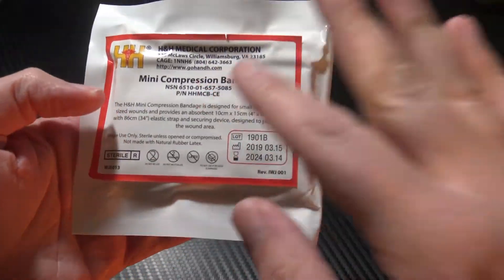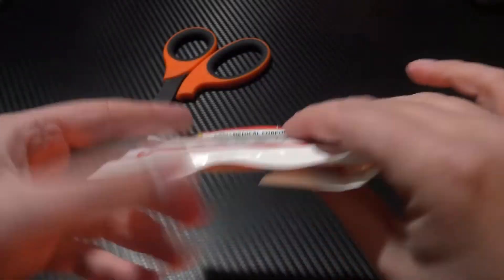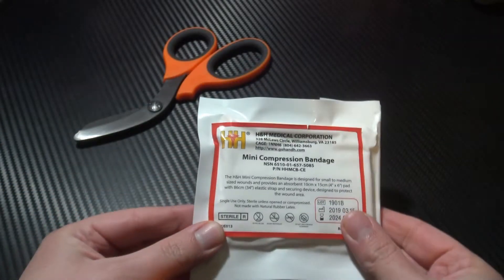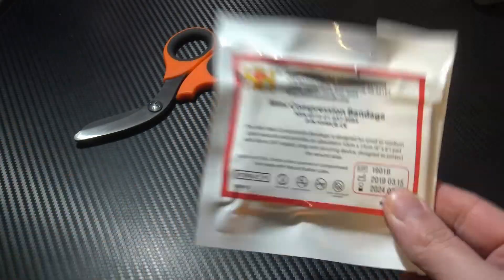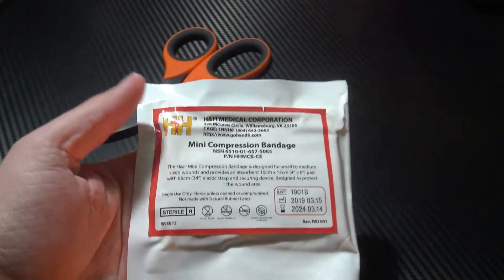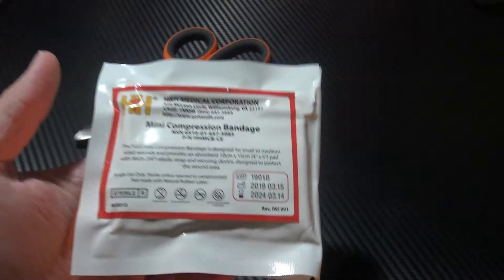This is the H&H Mini Compression Bandage. This is a really cool, really thin, really compact trauma dressing which is suitable for a wide range of applications and is battle tested and approved for use by numerous countries, law enforcement agencies and militaries around the world.